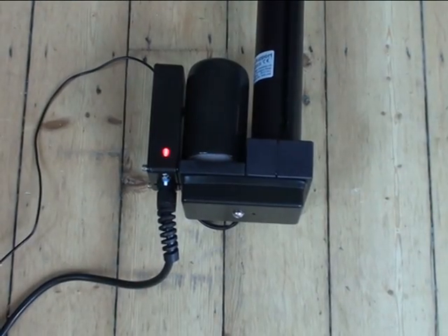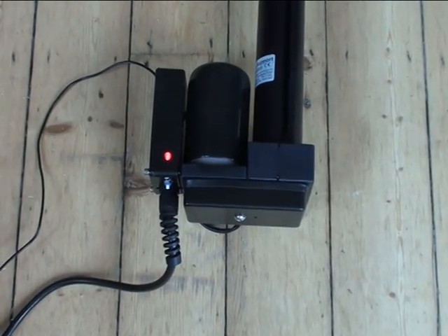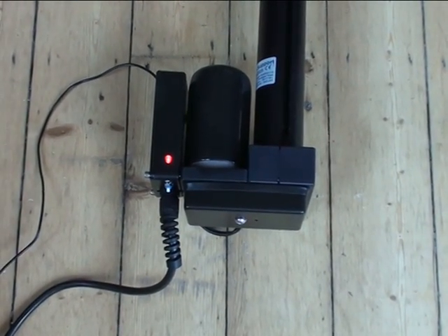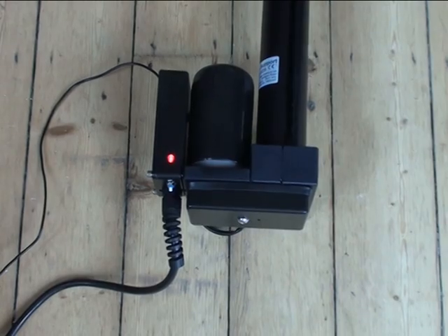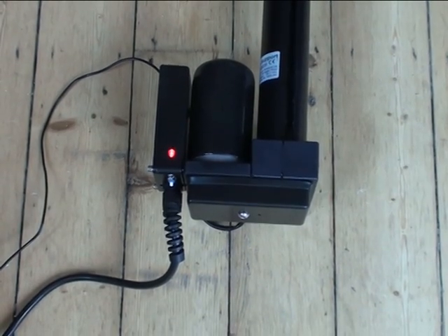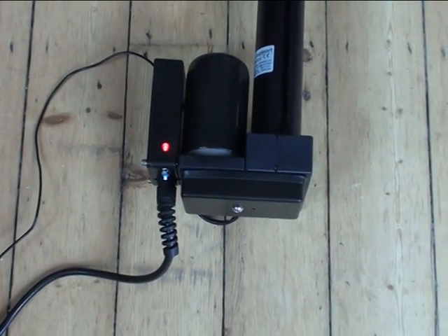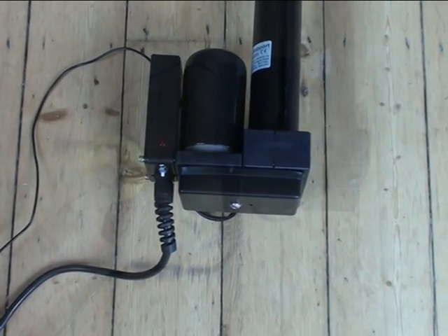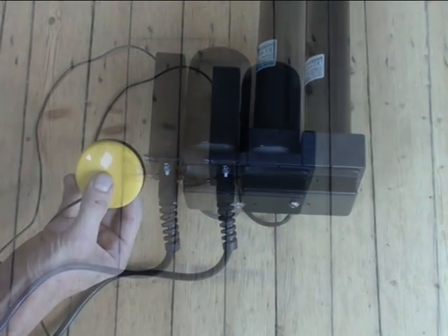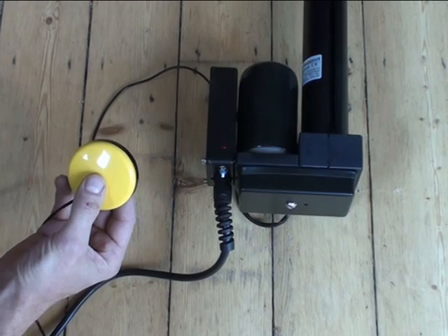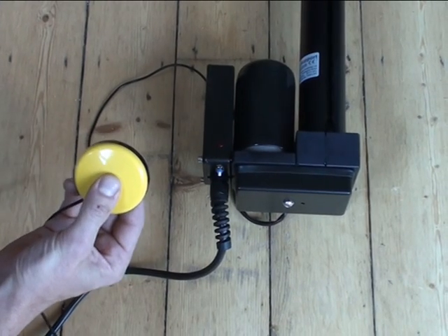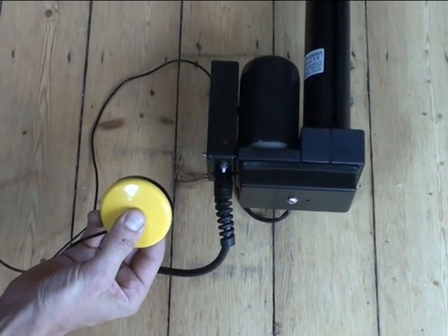You can start a recalibration at any time by unplugging the power and waiting until the light goes out. Then hold the switch whilst you plug the power in.